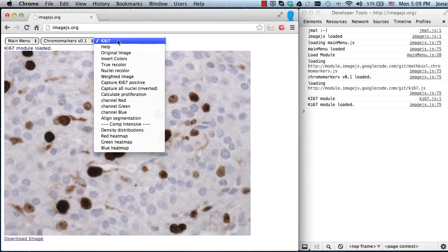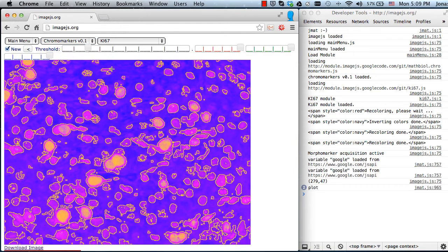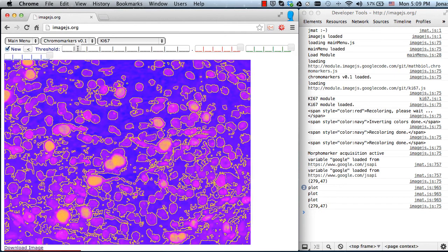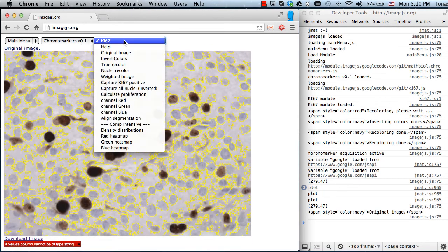So now I can start with the nuclei recolor. That's the digital filter we developed. So now we can start looking for the background, looking somewhere here. And I guess this would be maybe something less sensitive. Yeah, there we are. So you could look at the original image to find out if you like it or not. So go back and forth.